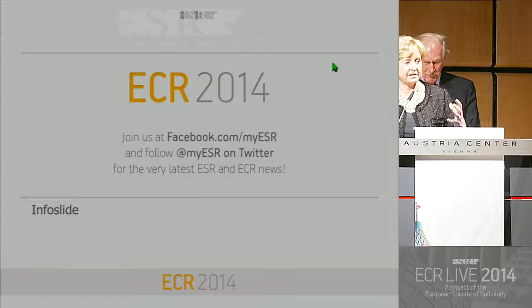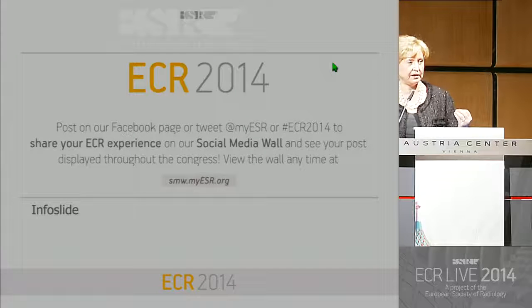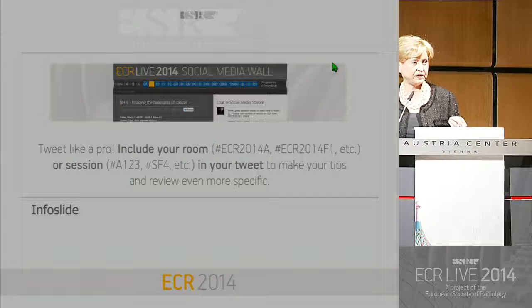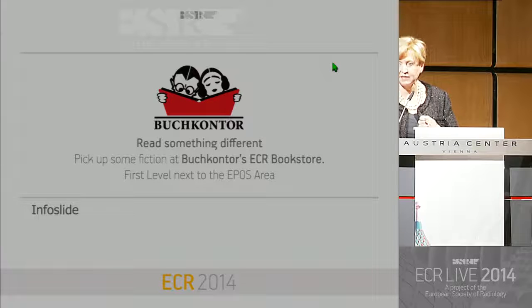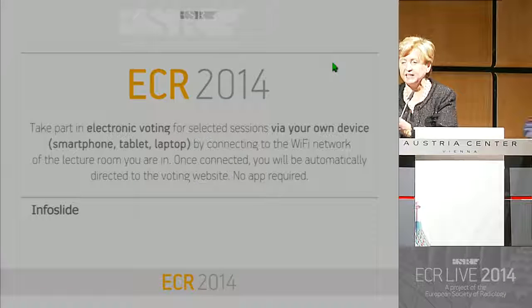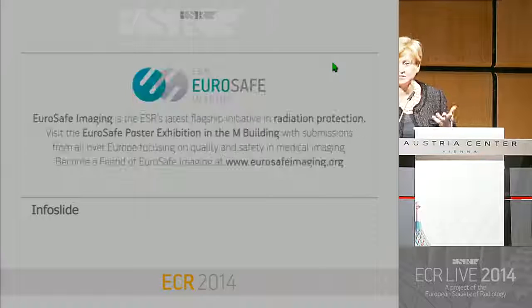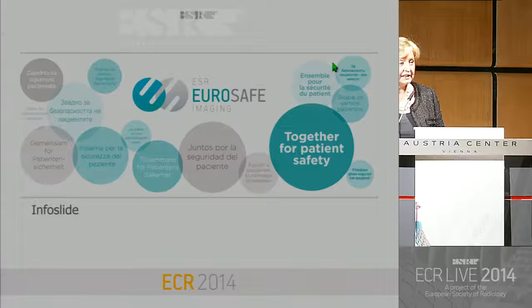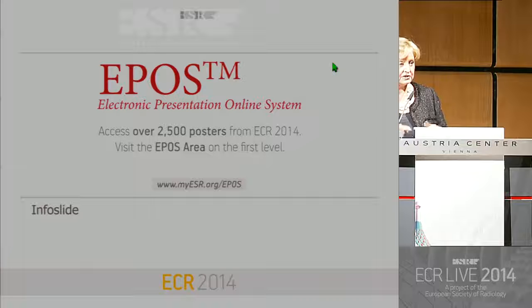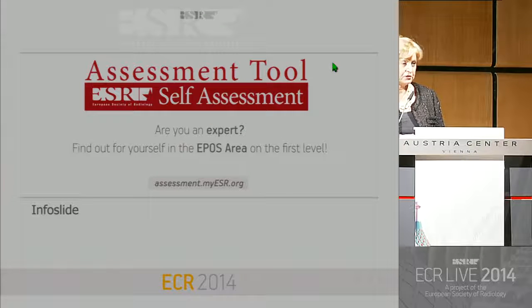In breast cancer, when you have an abnormality on any given modality, it means you need to biopsy. Now that they are working on the second edition of PI-RADS, it's really that if you definitely see a lesion on diffusion-weighted image, you need to biopsy regardless of what the other images show. But your question has been answered in the literature, and there are a number of cases where diffusion-weighted image is actually superior to findings on contrast.